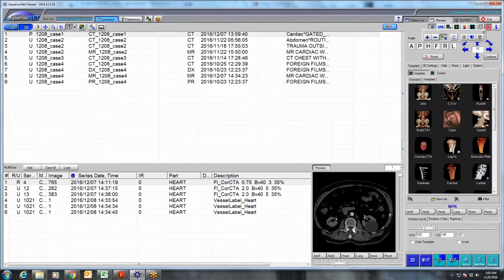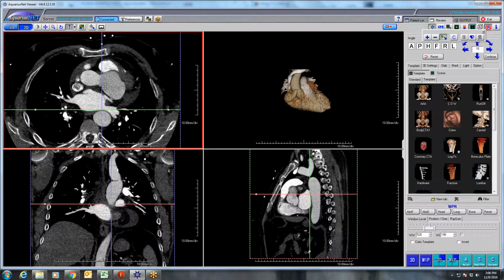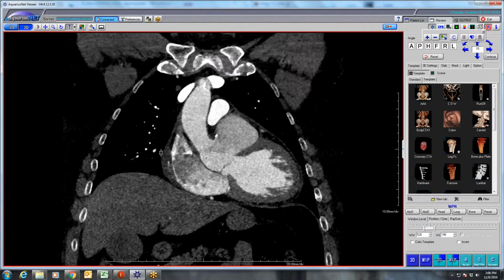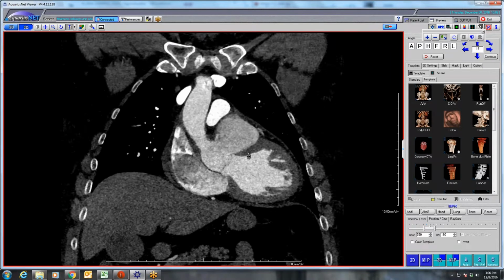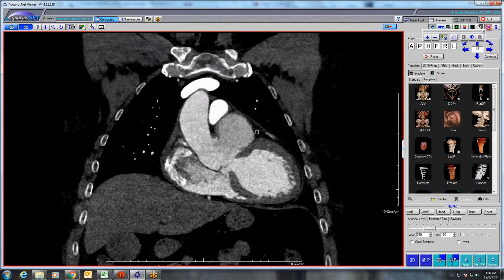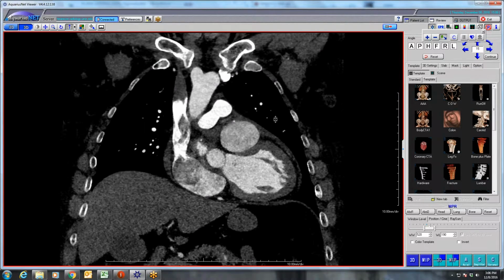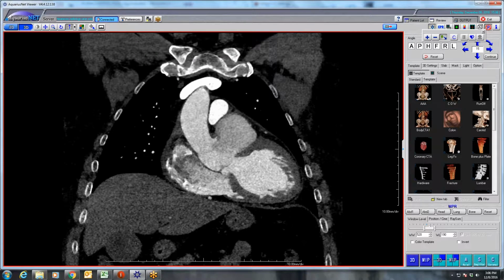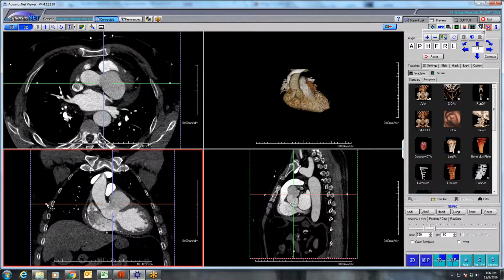You think this communicates with his LV then? Is that right? Oh, yeah, no, it definitely communicates. So here, it directly communicates. It's just this big, very wide mouth outpouching. Don't think it's a pseudoaneurysm. We got delays on it that show that it fills in completely. I really think this is a chronic or just a congenital process, this large sinus of Valsalva aneurysm. But I'm not quite clear. Does it have a communication with the LV or just the coronary sinus? No, I'm sorry, not the LV. I'm sorry, just the aorta.